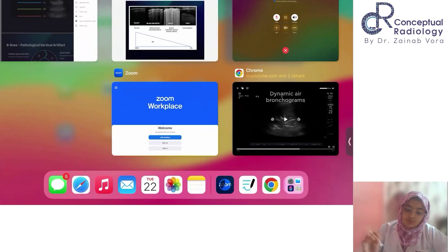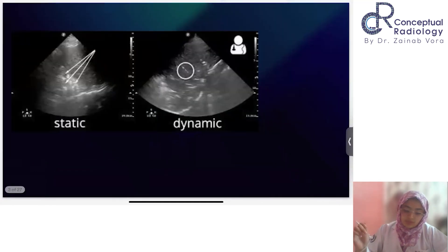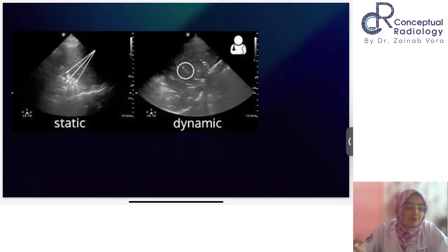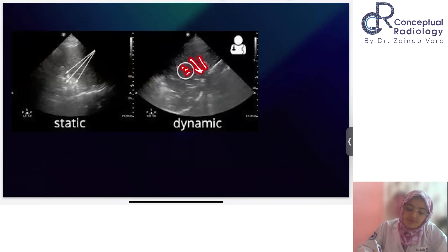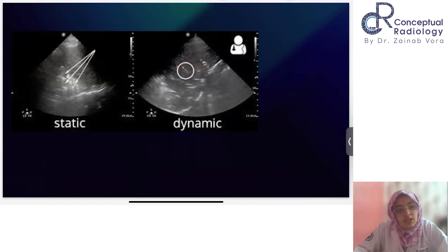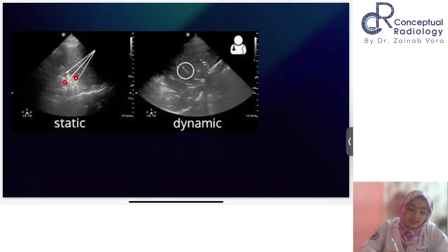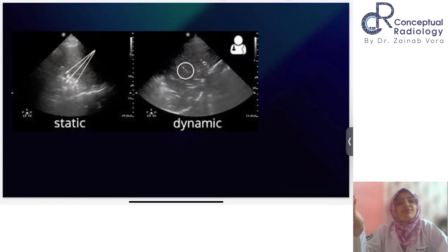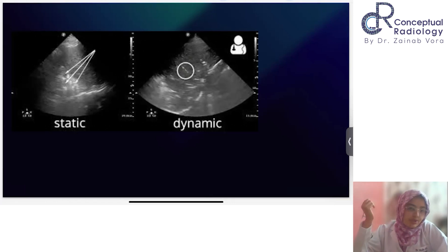In a static image it's not easy to understand, but once you have seen this video you can never forget how the air was coming and going with every respiration. In the static case there is obstruction, so there is no free passage of air with inspiration or expiration. But if it's a patent airway, every time with inspiration air comes in and with expiration some air goes out — and because of that you see that flickering movement.